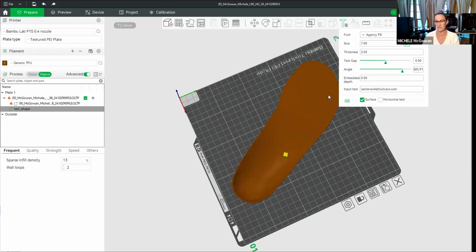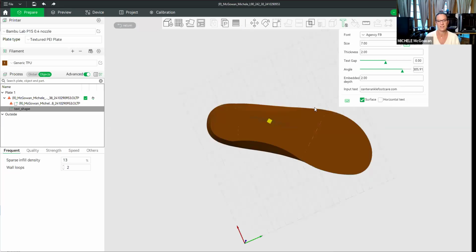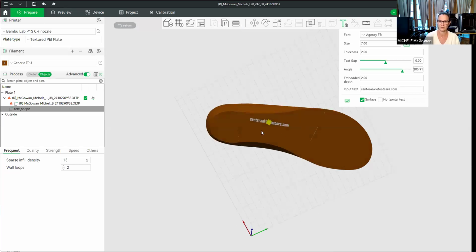One of the things I always say is you want to flip it over to make sure you don't see the text coming through. For example, you have to put an embed depth. If I put something crazy like 10, it's going to pop up here on the top, which means it's going to go all the way through the device. I don't want that. I just want it to be slightly engraved. I've played around with this, and 2 millimeters seems to work. So you see it's not coming through, and you see the practice name there, centeranklefootcare.com.